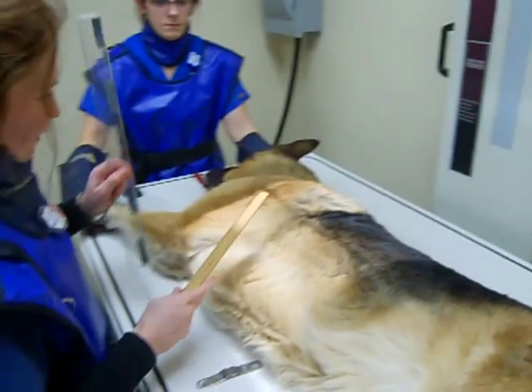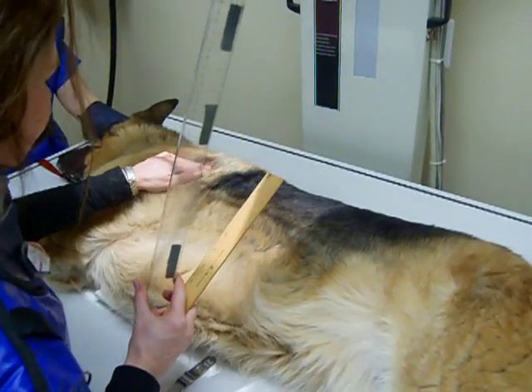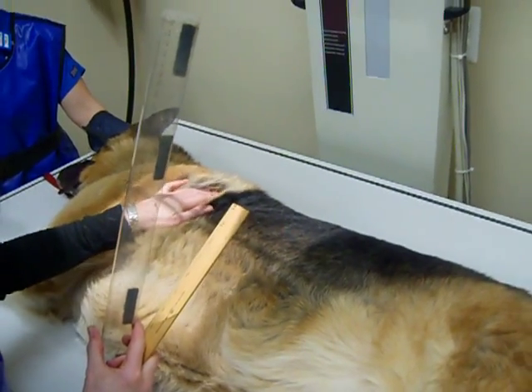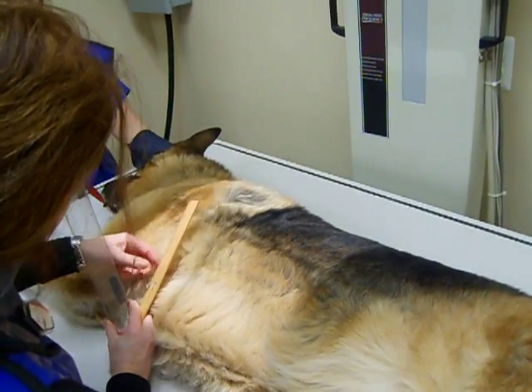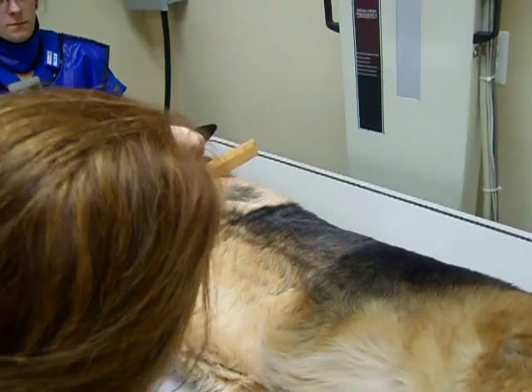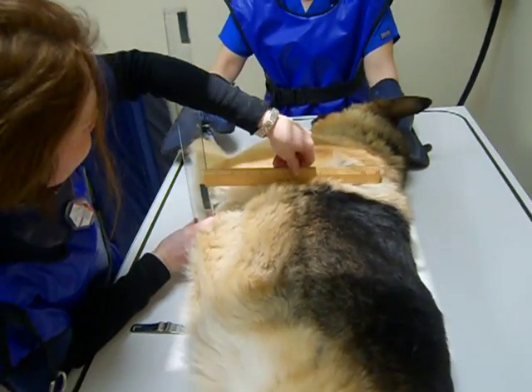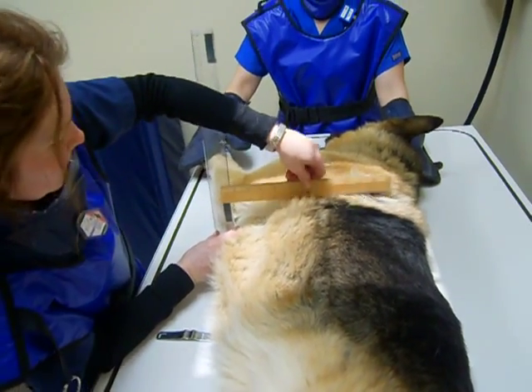In order to get our exposure factors, we need to measure with a thoracic radiograph from the caudal border of the scapula, which is around here. And he measures 15 centimetres.